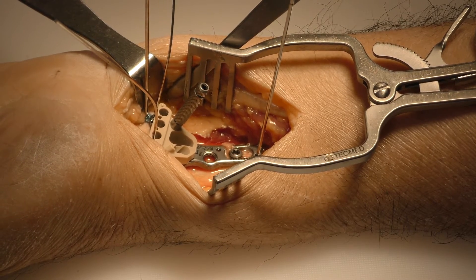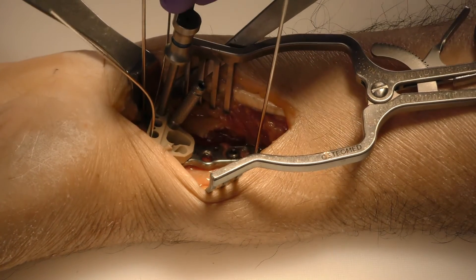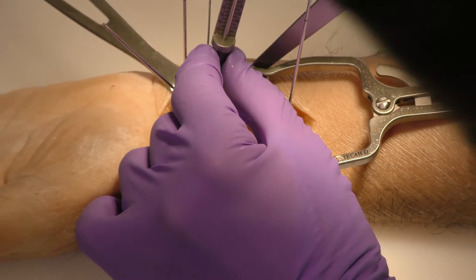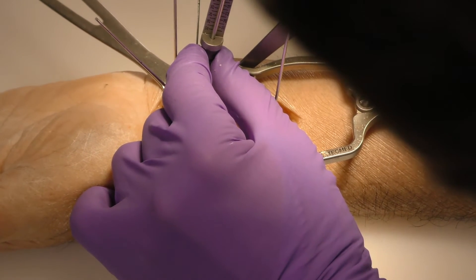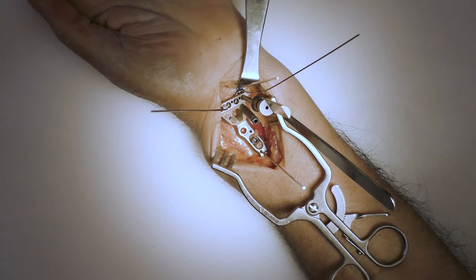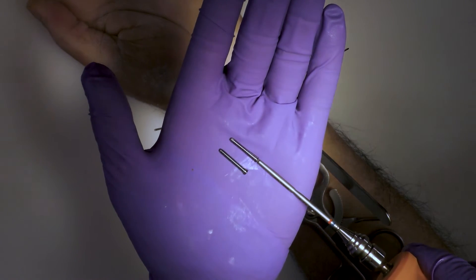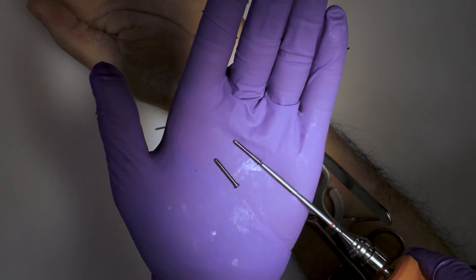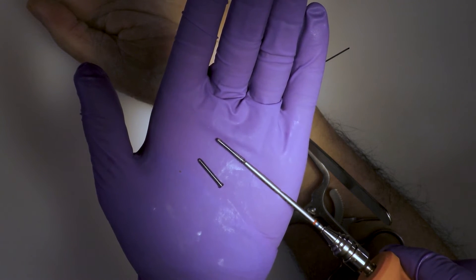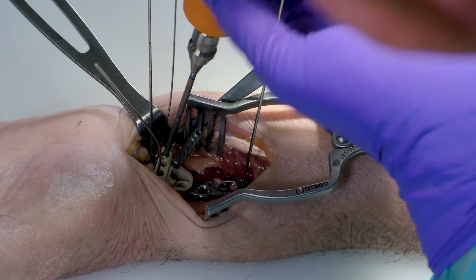There are two options for drilling your distal screw hole: you can use the lock-in guide through your PEEK guide, or you can use the drop-in guide. I'm more of a fan of the drop-in guide because you can hold it and measure off it a little bit more easily with the laser etching on the drill and the laser markings on the drop-in guide. You can then call for your screw, or use the drop-in probe to measure your screw length if you're unsure. To secure your avulsion hook plate and volar distal radius plate, you can utilize a distal non-locking screw or the titanium variable angle locking screw into the avulsion hook plate and the volar distal radius plate.